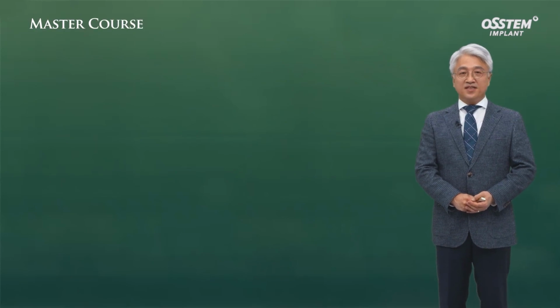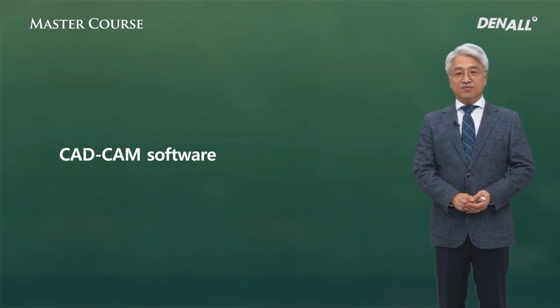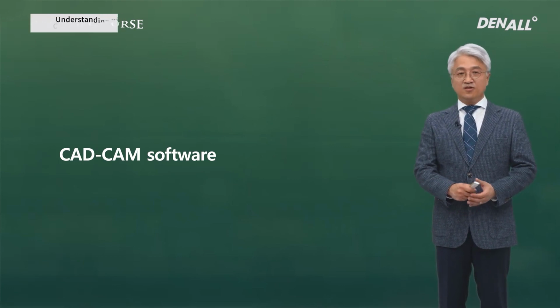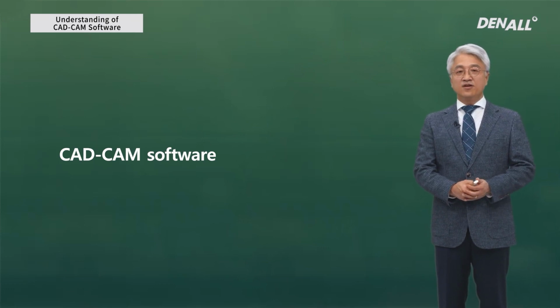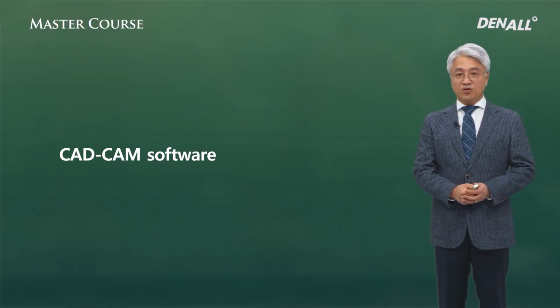I would like to summarize what I've mentioned today. If you think of CAD-CAM software, people think of prosthodontic CAD-CAM software. However, they can be applied to implant treatment and orthodontic treatment as well. You can proceed clinical treatment using these software. By using these software, you can provide accurate prosthesis with high-performing machines. Not only that, but you can improve the quality of your clinical treatment.